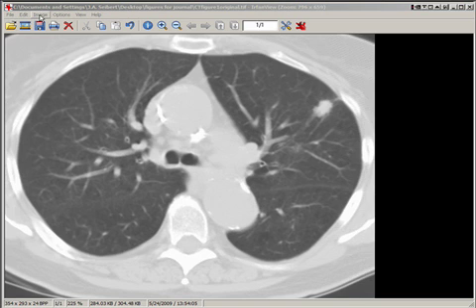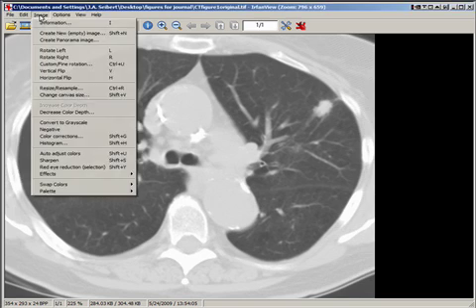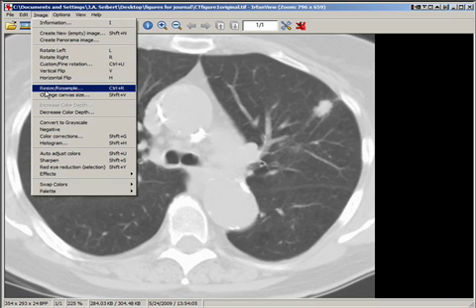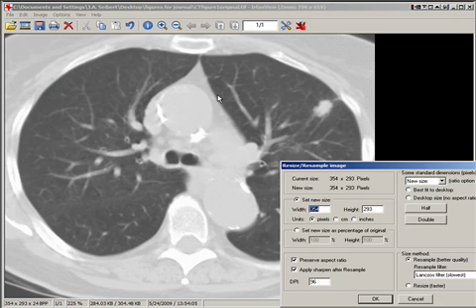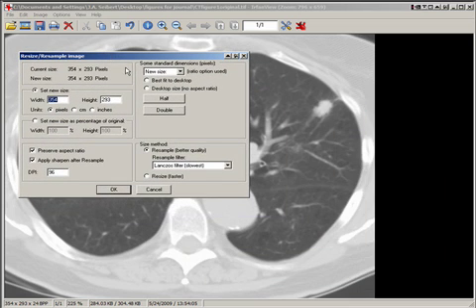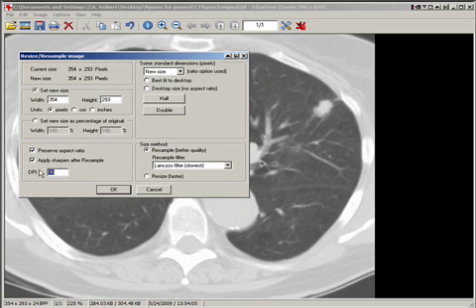Next, go to the Image tab on the main menu and select the Resize/Resample submenu. Here we have information that indicates the DPI, or resolution, in the lower left-hand box. To increase to 300 DPI, simply select the 96 that's currently set and type in 300.